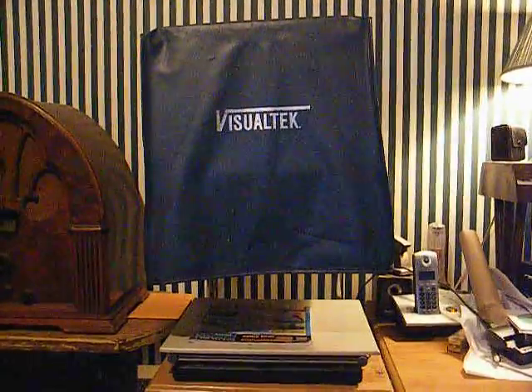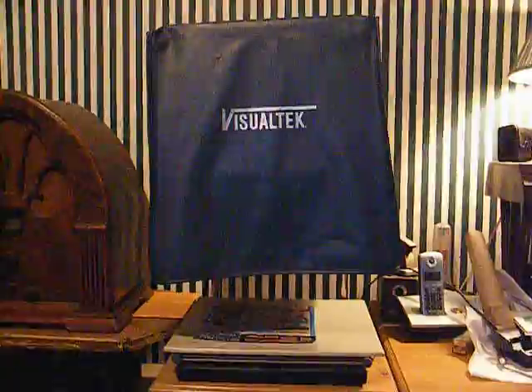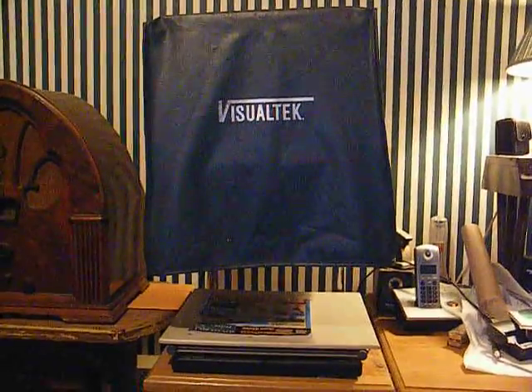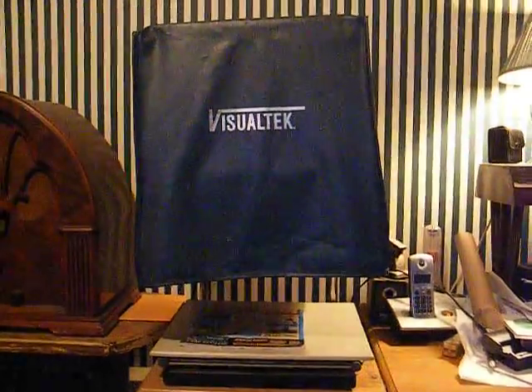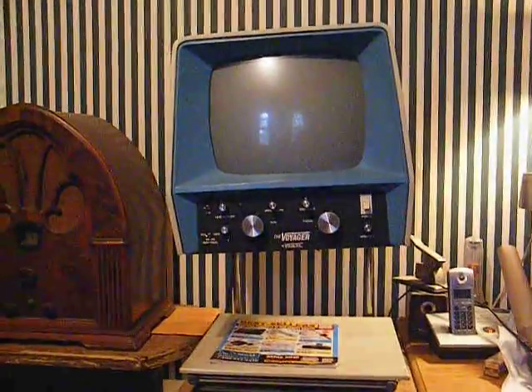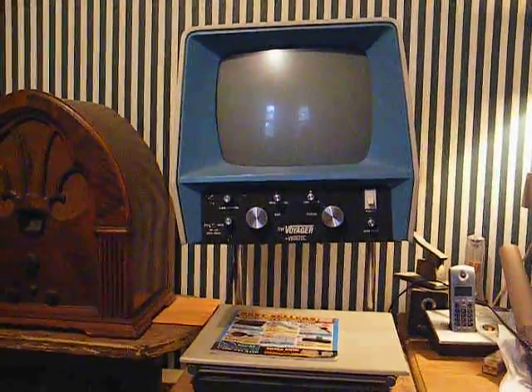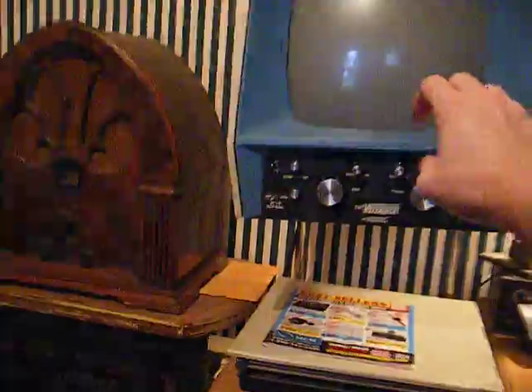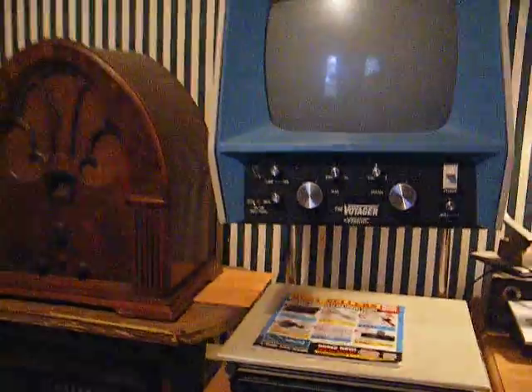What you're looking at is a Visual Tech closed circuit television video magnifier, which is designed for use by the visually impaired. I'll take the cover off so you can get a better look. What this does is it's designed where the user can place a piece of printed material or other object that he or she needs to enlarge — it magnifies it onto this television screen.